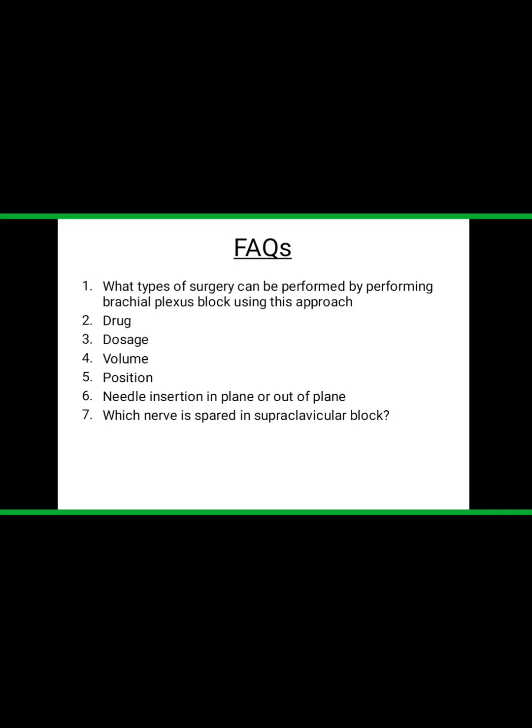Unless you see the tip of your needle, you are not supposed to give any drug, and you are not supposed to proceed the needle. You are not going to push the needle anywhere unless you confirm its tip, whether it is in a safe position, at a safe location or not. One more thing, if you are giving any drug and there is a high pressure or high resistance while giving any injection, you simply have to withdraw your needle a little bit, as you may be into a nerve element, like direct injury or entry into the trunk or division.